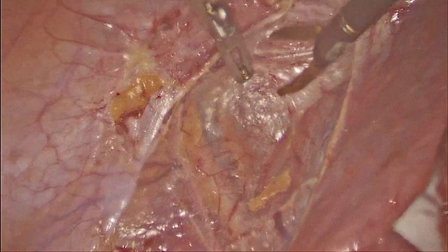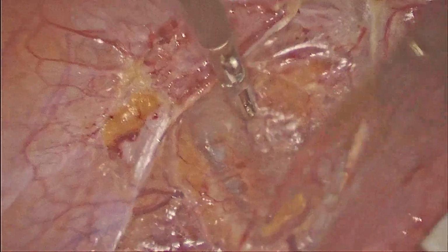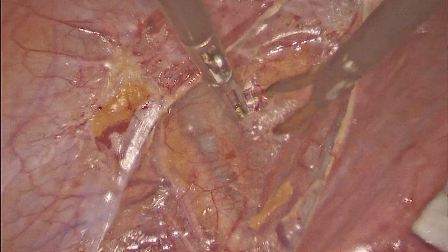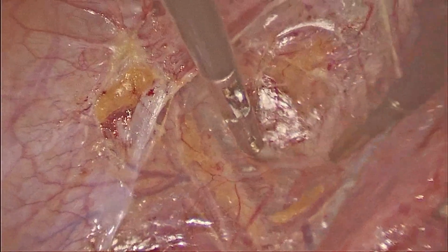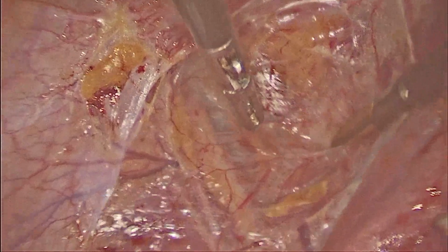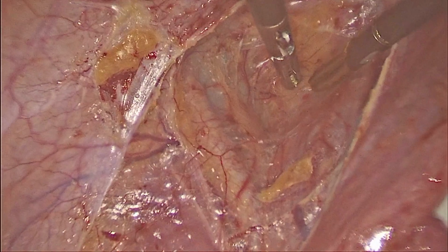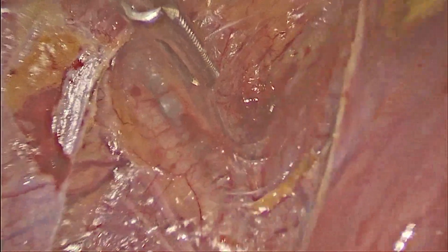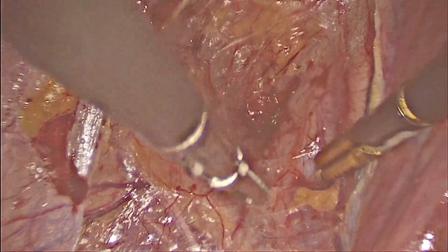So the first structures we usually come across are the external iliac vessels, the external iliac artery and external iliac vein, and then further dissecting deep down, we will see the ureter in the medial fold, and further down we will see the internal iliac artery. These are the routine structures seen in the retroperitoneal dissection.